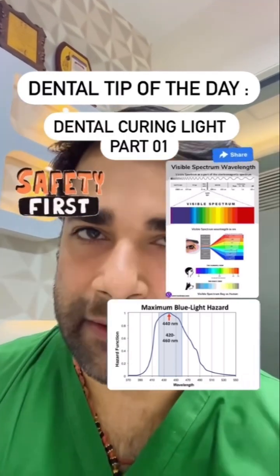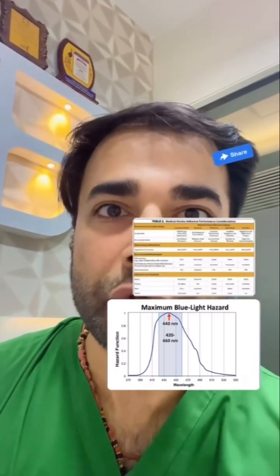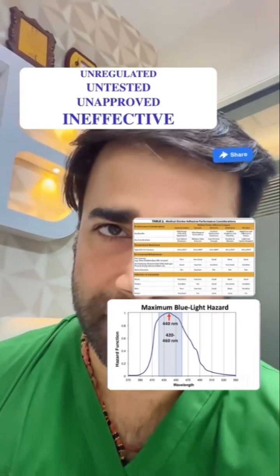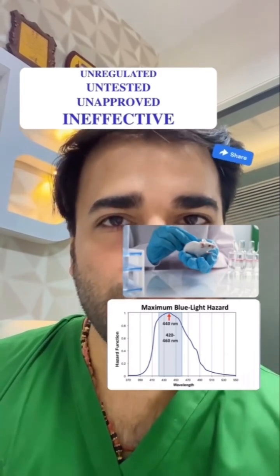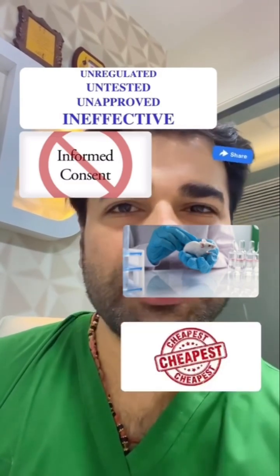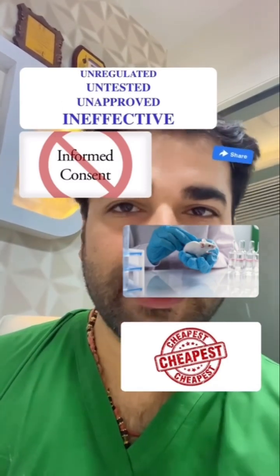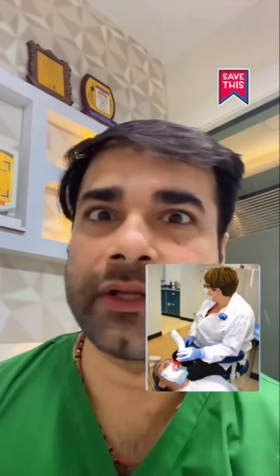Keeping this health hazard in mind, curing lights are medical devices, and the use of an unregulated and untested medical device on a patient should be regarded as in vivo testing on a patient who hasn't given informed consent. Will you still go and choose a cheaper yet untested, unheard XYZ brand of curing light from manufacturers and suppliers who give throwaway discounts just so that you buy this?